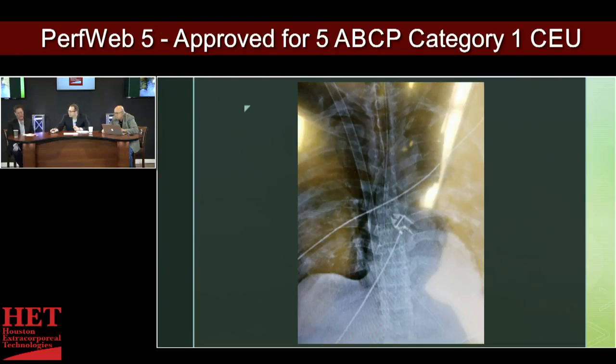Could we rely, I'm sorry to interrupt, but could we rely on the diaphragm as a marker and say we want to be at least one rib above the diaphragm? But again, it goes back to the technique of the film. Right, what's the angle and all that. The angle and all that sort of stuff.